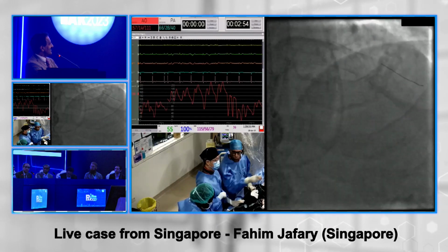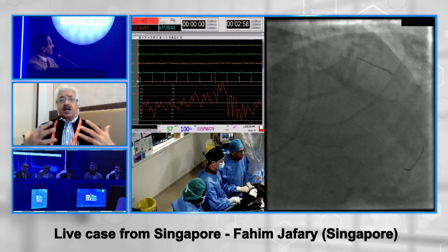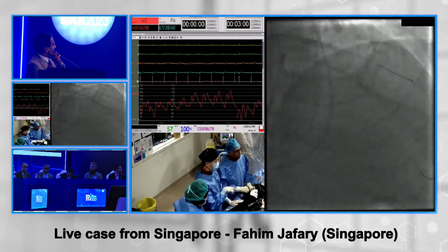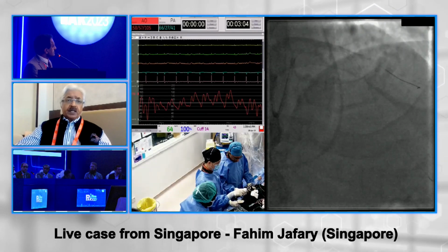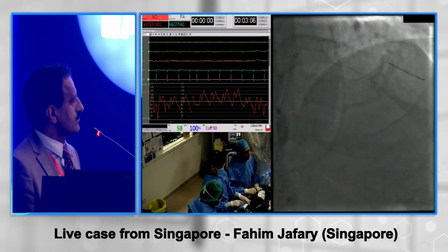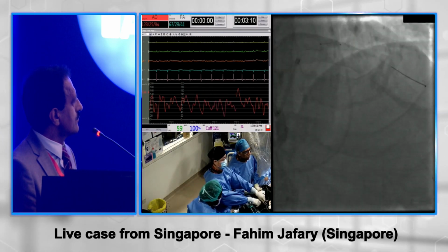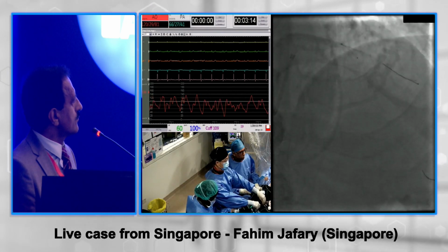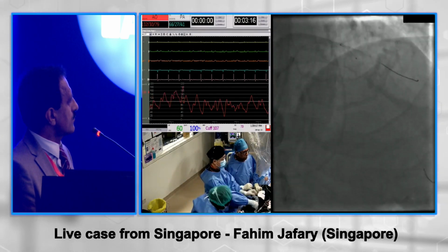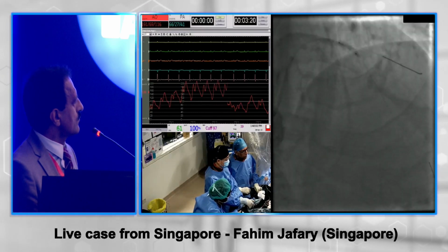But I must say that in a 3.5 millimeter vessel, post-stent implantation, if the MSAs are not adequate even after IVL, OPN is the choice, and the OPN should be 3 in a 3.5 vessel going up to 40 atmospheres, maintaining for as long as possible, which could be 30 seconds to a minute, 2 or 3 inflations prior to going up on the OPN size, and it should never be without imaging. OPN at high pressure should always be used with imaging.